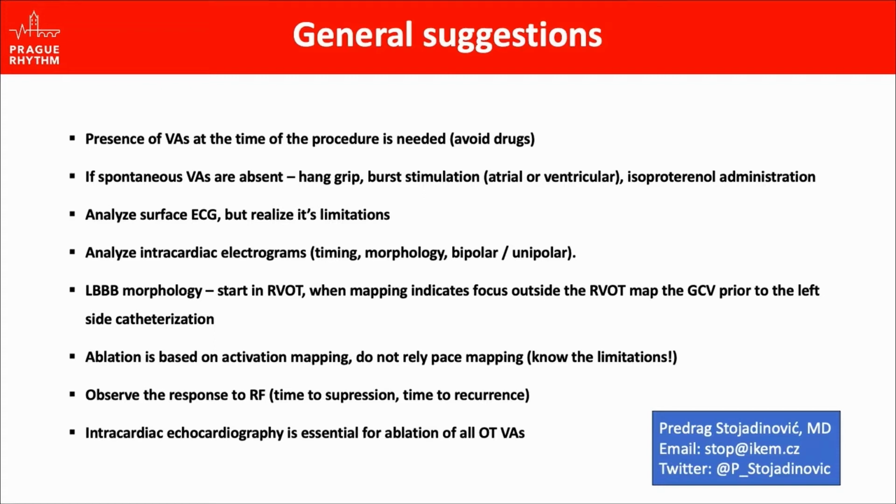Ablation of the PVCs coming from the outflow tract is based on activation mapping, so we should not rely on pace mapping, or at least we should know the limitation of the pace mapping. During the ablation, we need to observe the response to the RF energy application. Especially, we wanted to know what's the time to suppression, what's the time to recurrence of the PVCs.